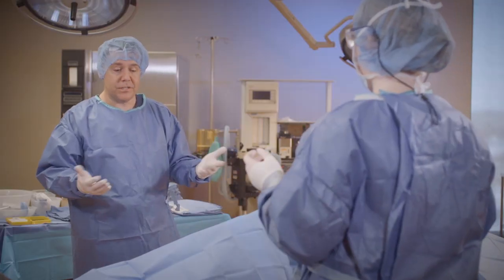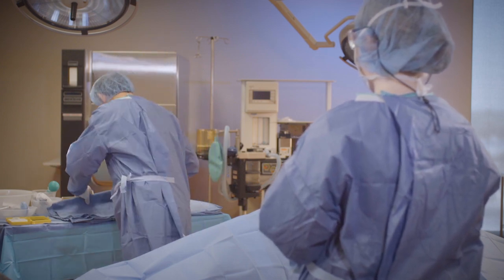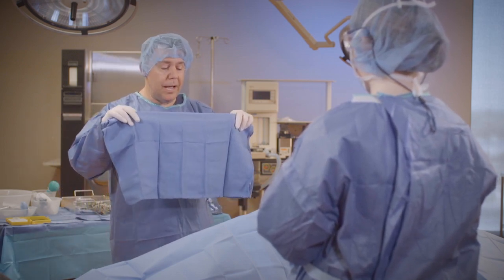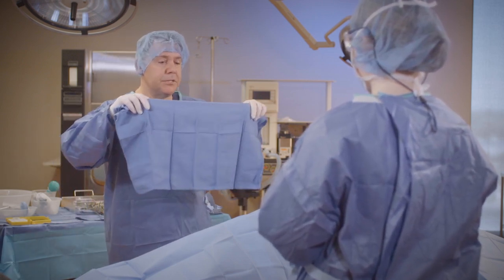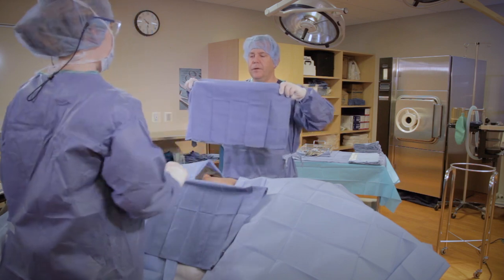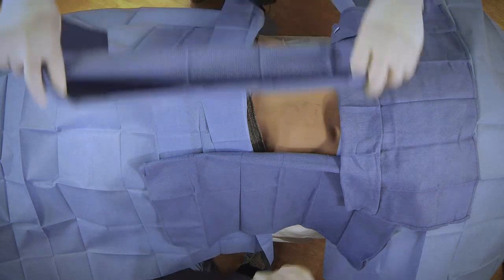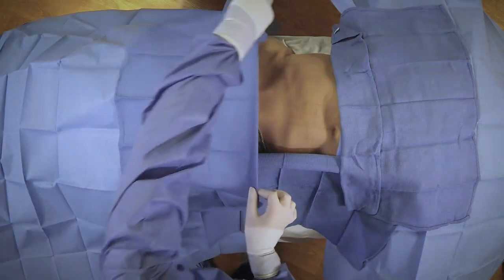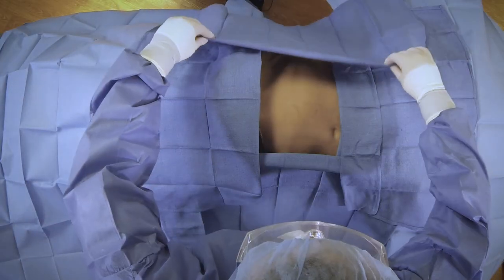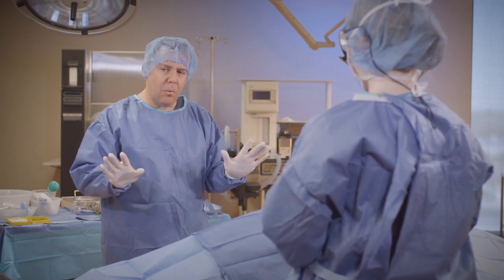Next are the towels. We want to make sure that we have already prepared the towels ahead of time and we bring all four up at the same time. My surgeon is going to grab the first towel and place it on their side. Next we are going to go superiorly or the top side, inferiorly or the bottom side, and then the last side is my side. I always made sure that I was at least 12 to 18 inches away from the field, even though I am protected by a drape, I still don't want to risk contamination.